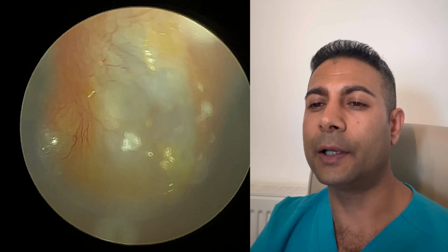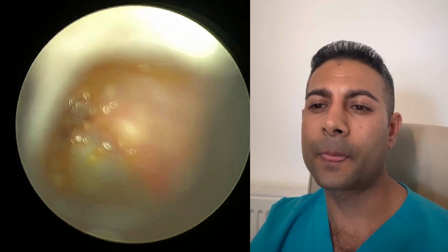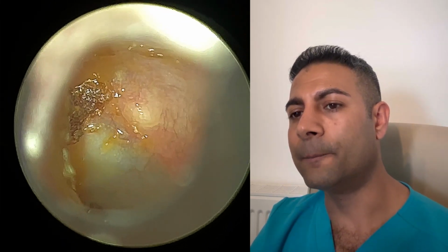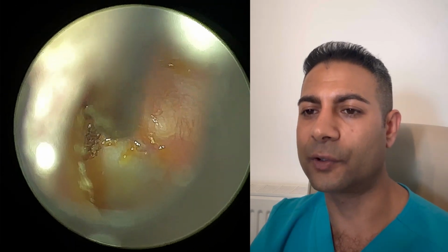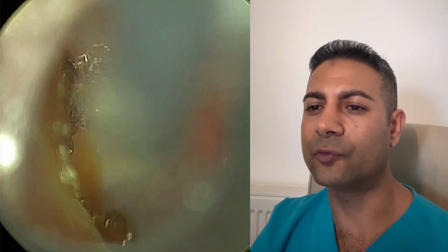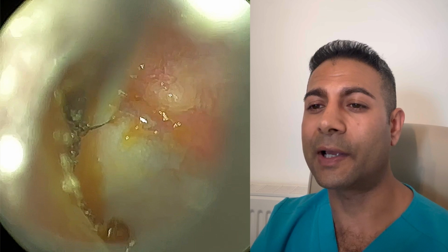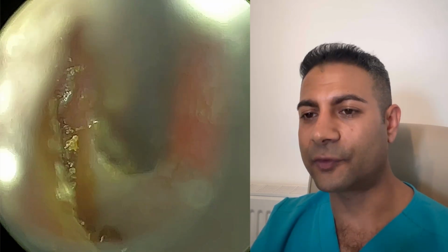So again, I'm just going to re-enter. I've just zoomed out for a moment. It's just a little bit left. Truth be told, we could have probably left this, but because they've got such a prominent anterior recess, I just want to get as much out as possible, because I don't think this is self-migrating. Unless it's cleaned out, this part of this patient's ear canal is always going to collect a bit of dead skin and wax, and by removing it, it potentially helps the next layer of skin to fully migrate.